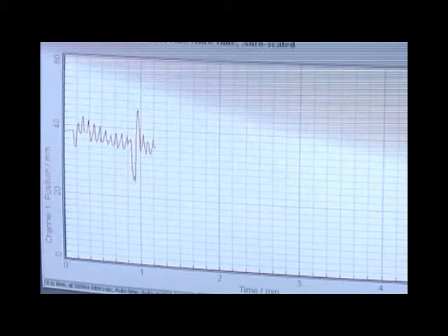Notice that the trace is sloping away again to the right. This has already been explained and is due to oxygen consumption. On this simple trace, try counting the number of breaths taken and see if you can work out the tidal volume represented by each breath in squares of graph paper. Have a look at the worksheet for more detailed spirometer traces for you to interpret.